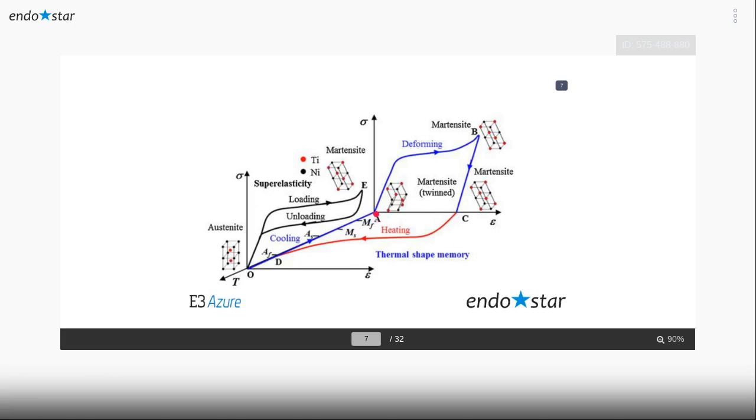But if we start from this point, which is the martensitic point, the file can undergo deformation within the elastic range till it reaches here, the point of plastic deformation. But in austenitic, you have one point and we can go to plastic deformation, which means file fracture. That's why martensitic files have been produced, not only to pre-curve the file for inaccessible areas so you can insert it inside the canal, but also to take more maneuvers, more curves inside the canal.